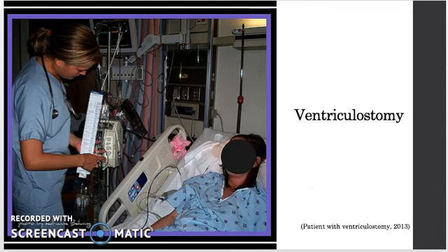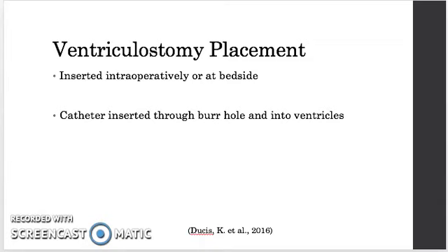This picture offers another look at nursing care with ventriculostomy. It's a very hands-on, very critical thinking tool that nurses must be comfortable using and be very familiar with. You can see that the transducer is at the level of the patient's ear tragus. This is important because we don't want to move around the pressure transducer, which could create a vacuum and give us an erroneous reading of ICP.